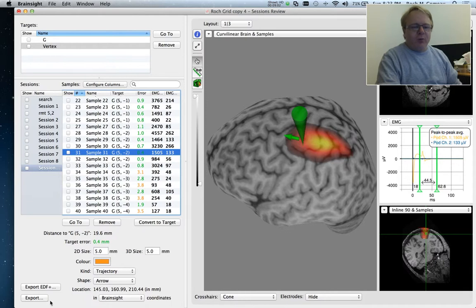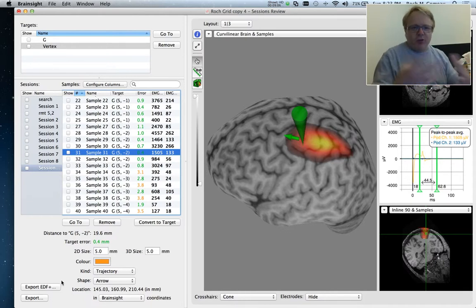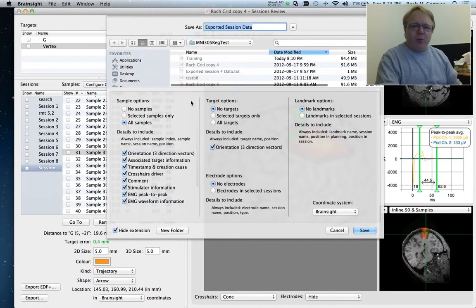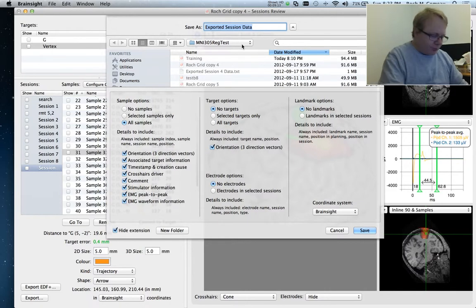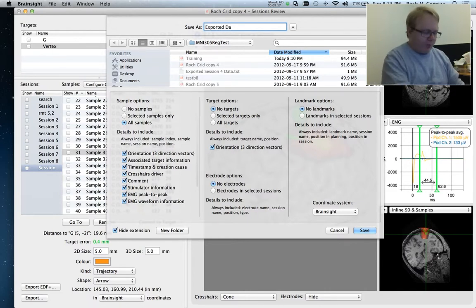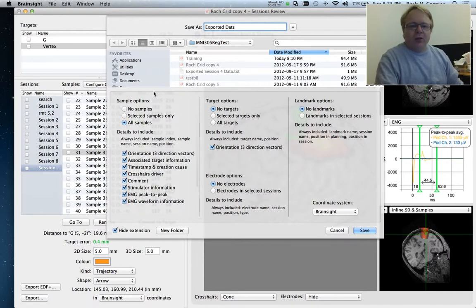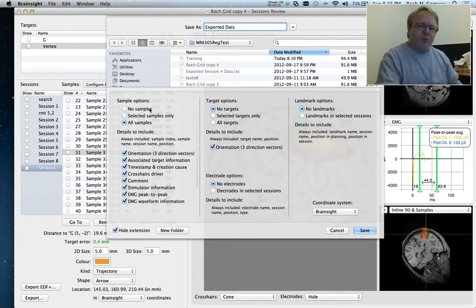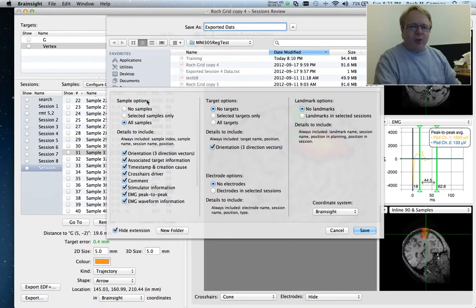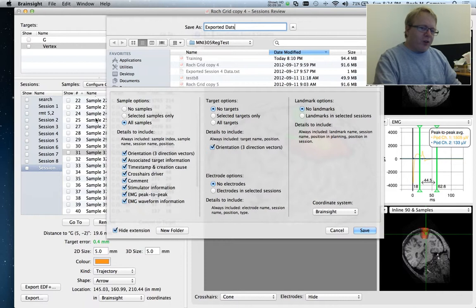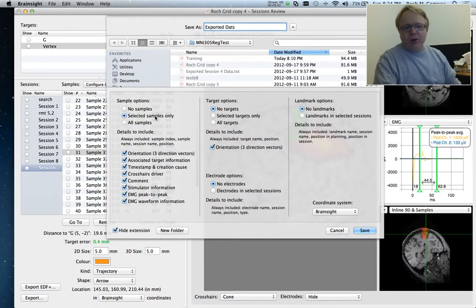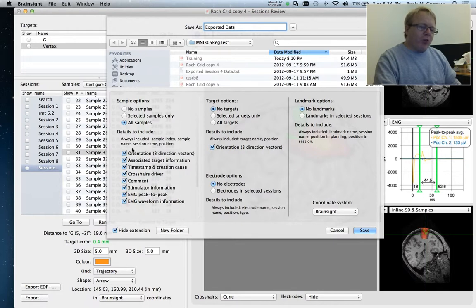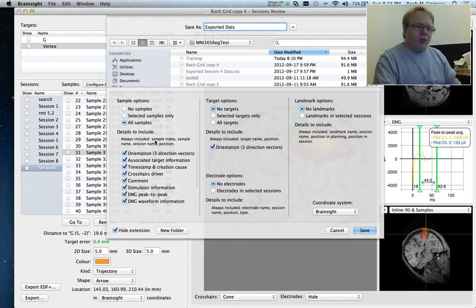Now, we can also export this information. So it's nice to have it within BrainSight, and you can use it to visualize things. But you may want to do your own analysis. So you click on export, and we bring up an export sheet. Give it a name. Now, this will create a tab-delimited file format. Now, there are three sections into this file. One, all your samples. Second section, your targets. And the third section, the actual landmarks used for co-registration. So let's look at the samples more carefully. We can choose to export all the samples. Or we could have selected a subset of the samples in the list and asked it to export only those selected samples. Or for some reason, we can export no samples. We can also decide what we want to export in that file associated with each sample.